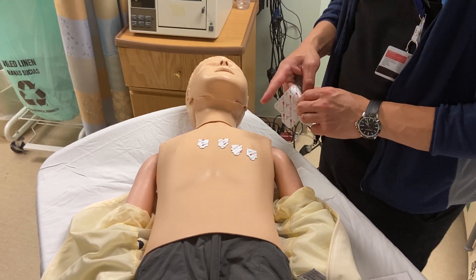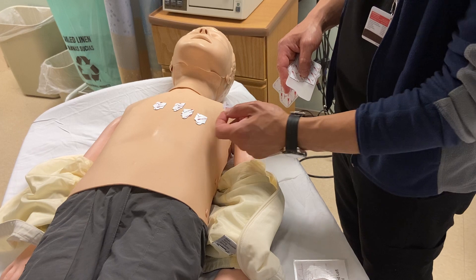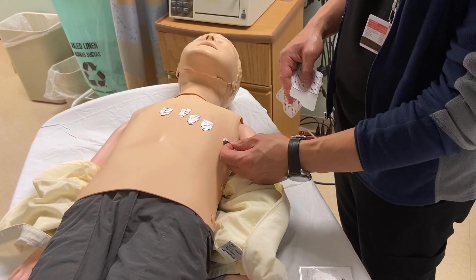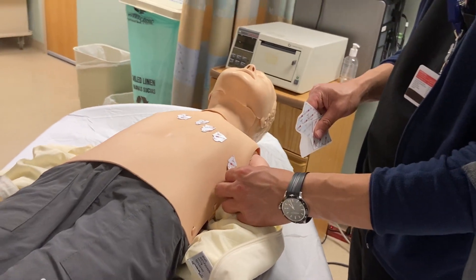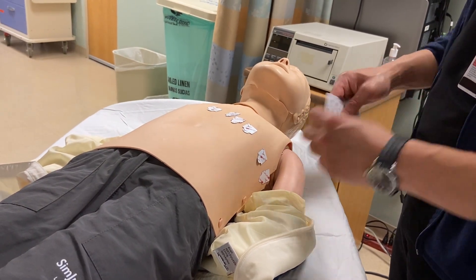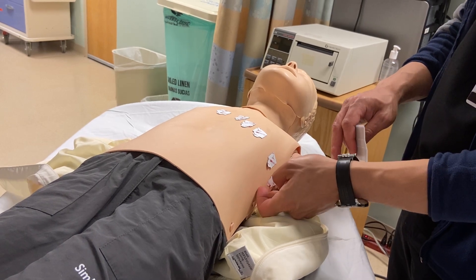V5 will stay in the fifth intercostal space right across from V4, except it'll be in the anterior axillary line, just in the front of the armpit. Then V6 will be in the mid-axillary line, staying in the fifth intercostal space. V7 will be just past that in the fifth intercostal space in the axilla.